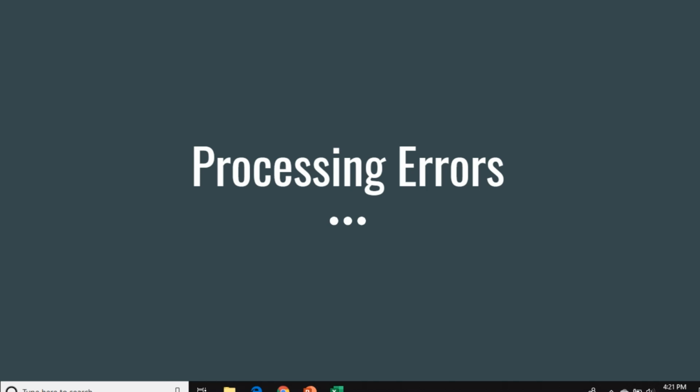This unit is going to talk about processing errors, and processing problems can give you a non-diagnostic radiograph. And if the radiograph is non-diagnostic, it could result in a retake. So now, again, you've given that patient extra radiation. So we need to pay attention when we are developing our films or processing our films.